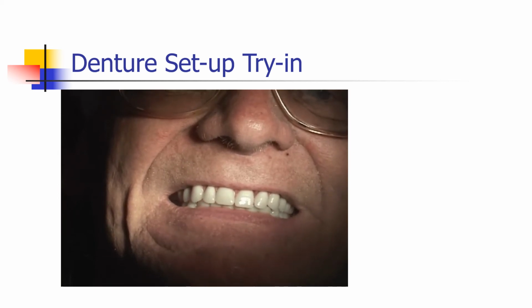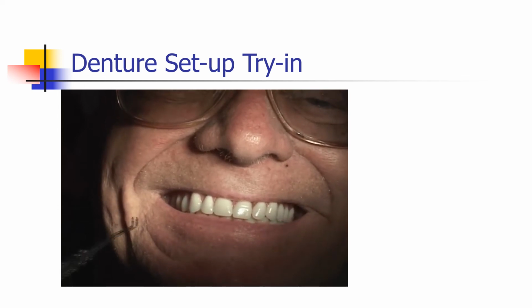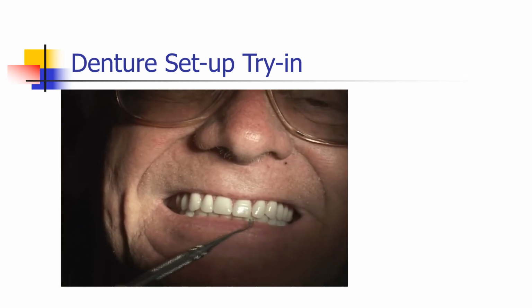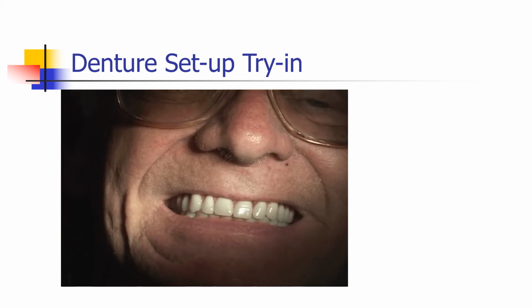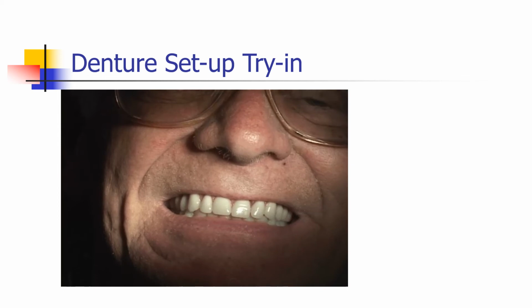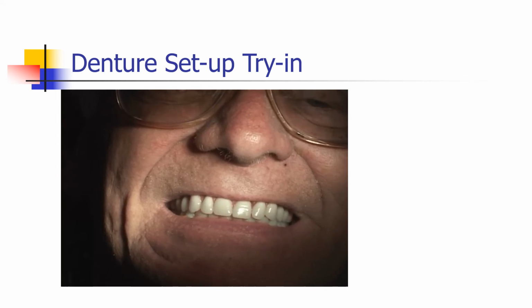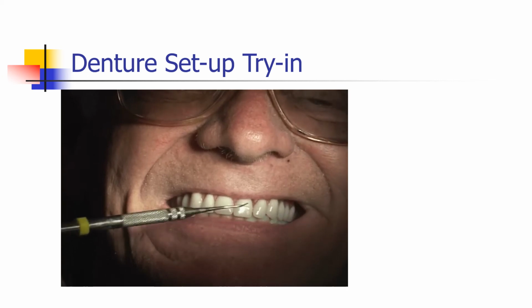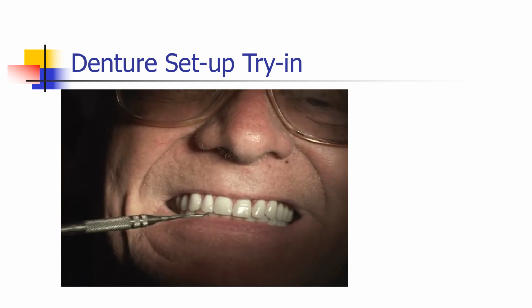And when you smile, the lower lip line or smile line, the teeth fall into the smile line. He's got kind of a flat lower lip, but it fits well into the smile line. And the upper lip line comes right to the top of the teeth.